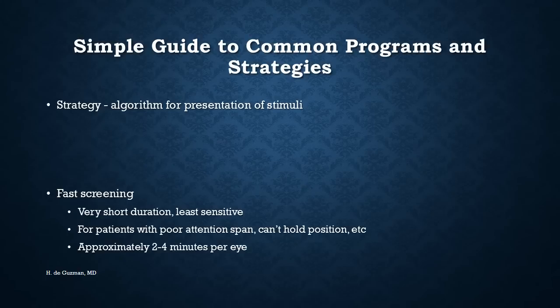The fast screening tests are very short in duration, but they're the least sensitive. So they're only recommended for patients with poor attention span or who won't be able to stay in the testing position for long enough. So it's about 2 to 4 minutes per eye.